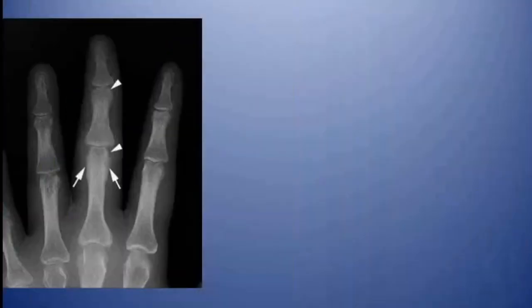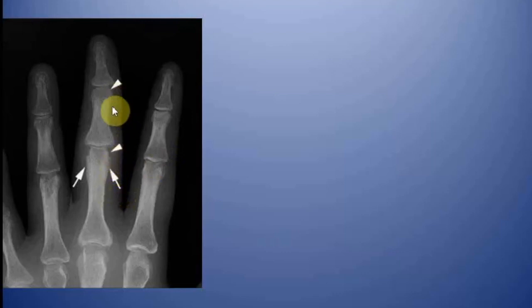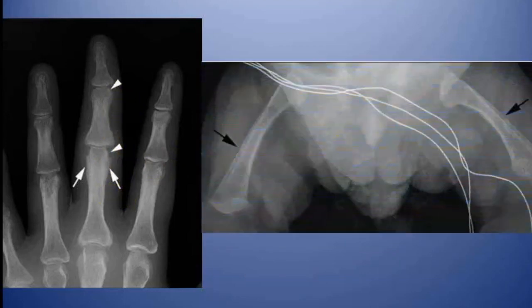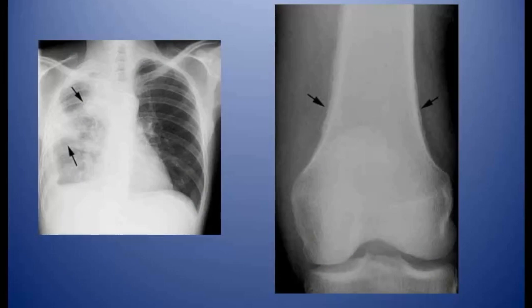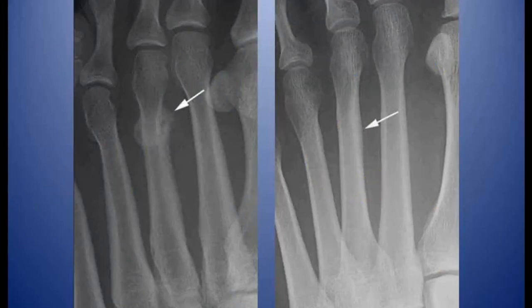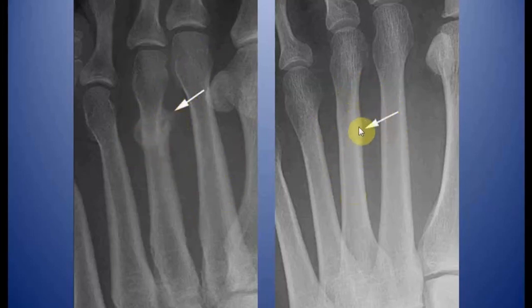Apart from tumors, multiple other entities can lead to periosteal reaction. This case of psoriatic arthritis shows thick solid periosteal reaction along with erosion. This radiograph of an infant shows physiological periostitis involving both femurs. This case of bronchogenic carcinoma has led to a paraneoplastic syndrome — the patient developed hypertrophic osteoarthropathy with periosteal reaction at the lower end of the femur. This case of a stress fracture involving a metatarsal shows an organized pattern of periosteal reaction, and after healing there is only thin solid periosteal reaction.